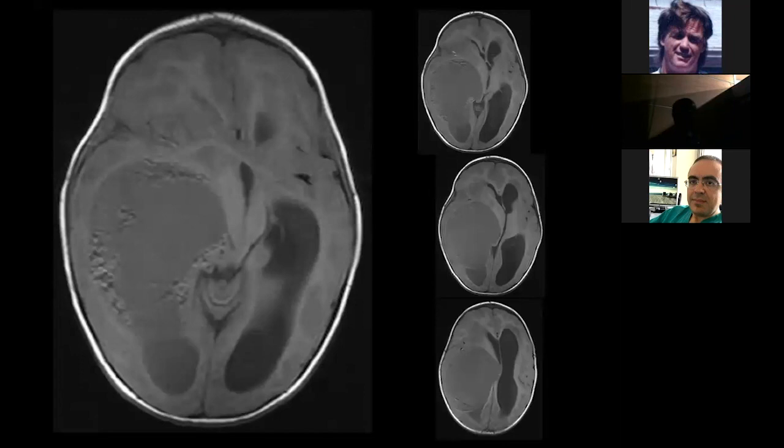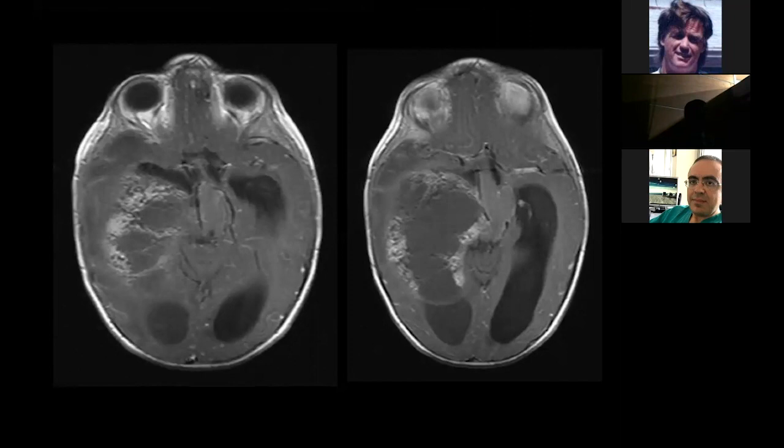Look at this. This is a dying person. This boy, his leg is in his grave. He is going to die, except for God's will. Look at the shift. Look at the pressure on the midbrain. Look at this, a very vague tumor. It's very ugly, not well defined, it is hazy. But look at the shift it's causing and the hydrocephalus it is causing.